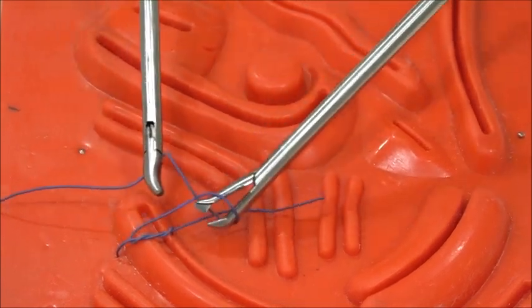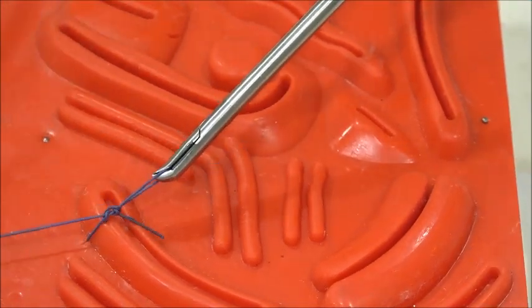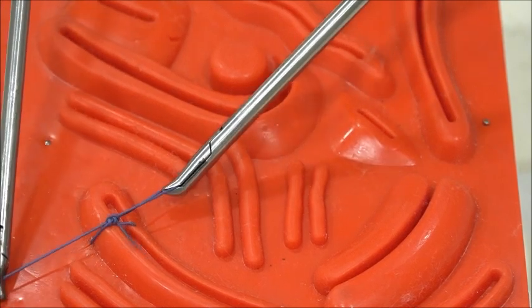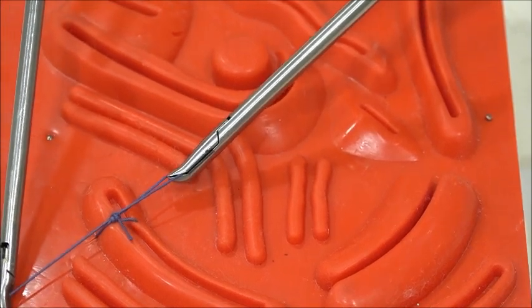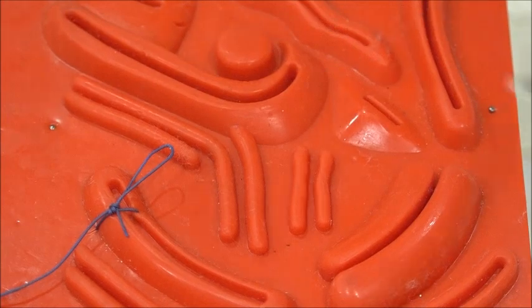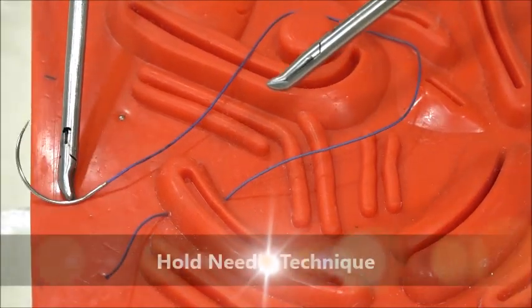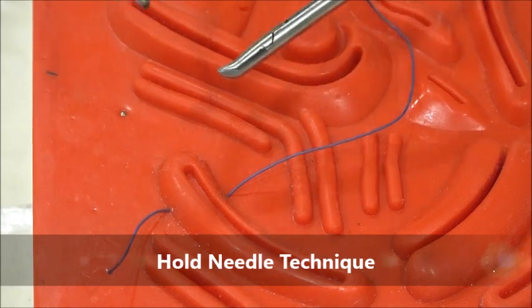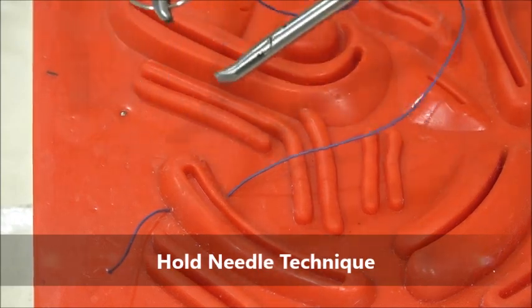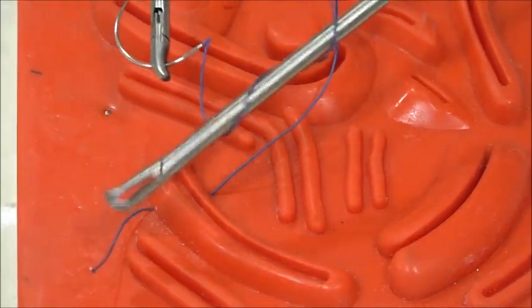Again, one wrap is taken to hold the tail. Again, one wrap is taken. Two, one, one—we use here. Two wraps, one wrap, one wrap. While tying, we should not pull the tail excessively. We should not have traction to the tissues.